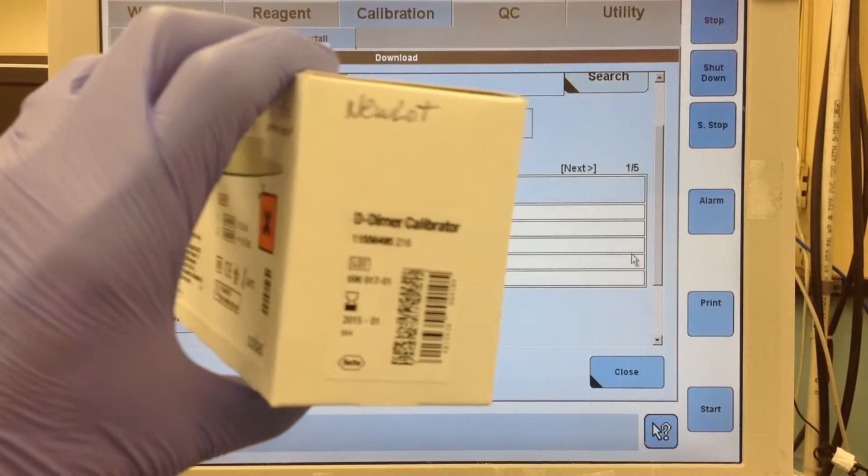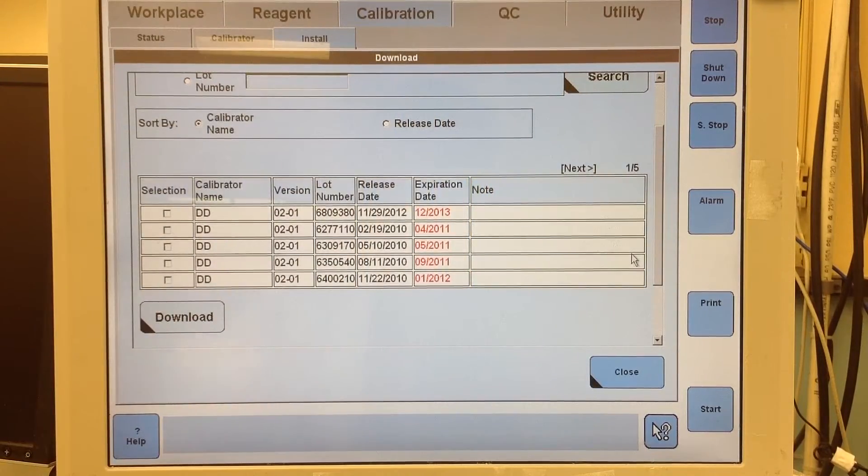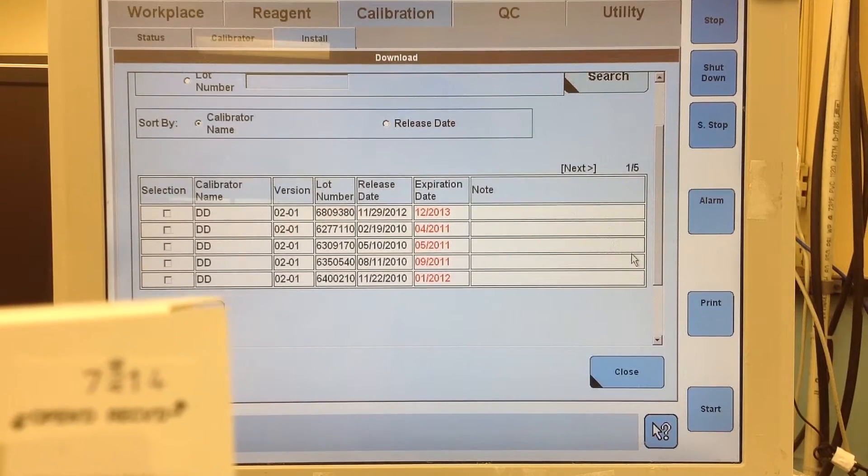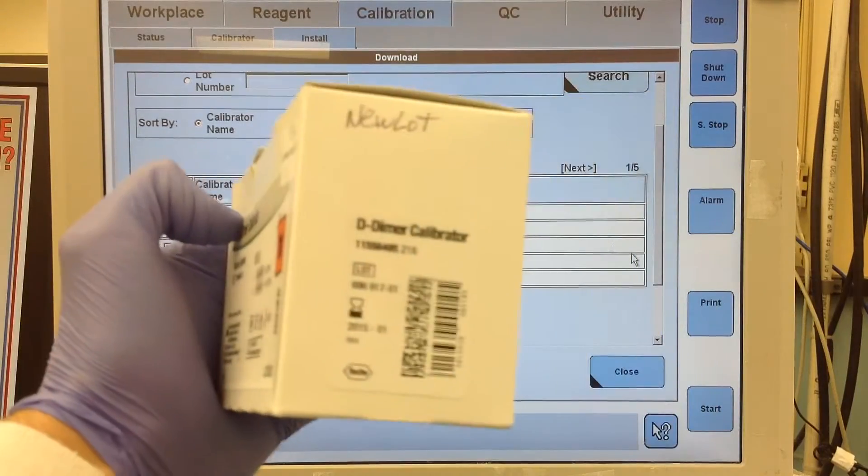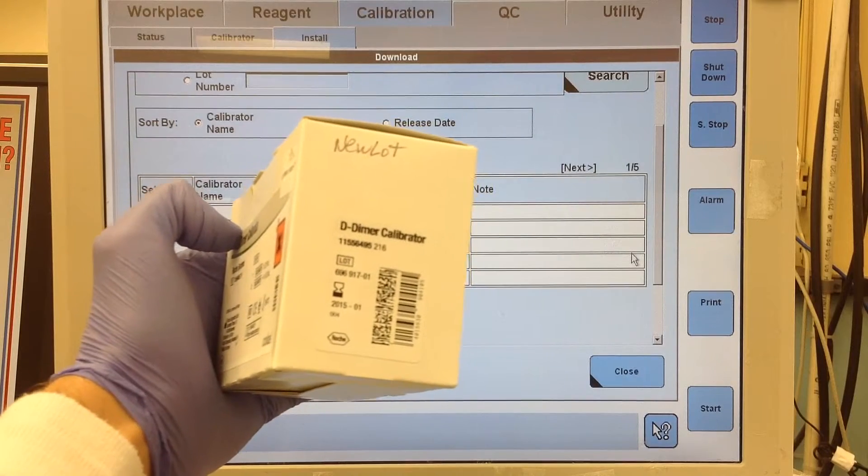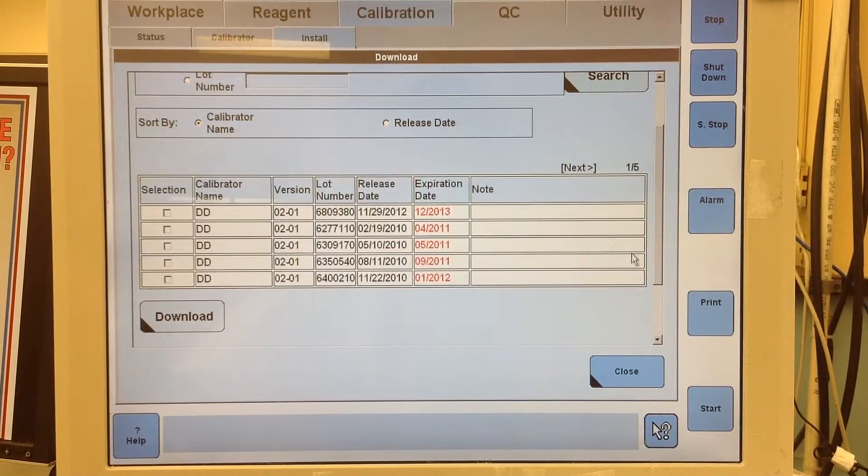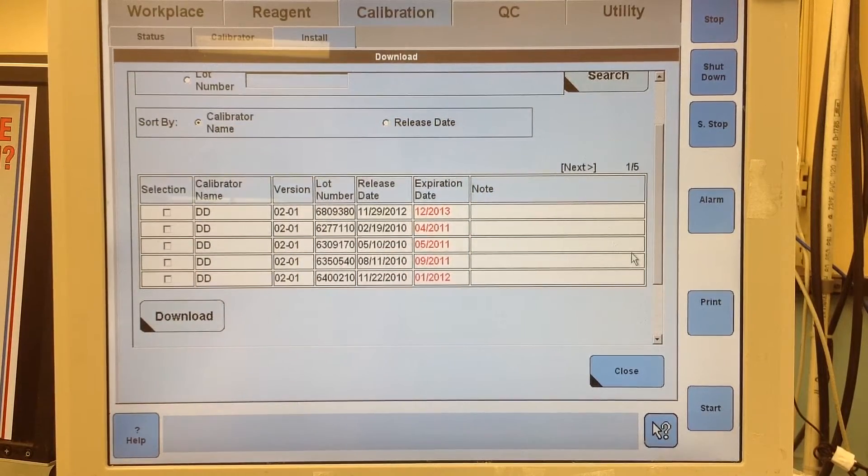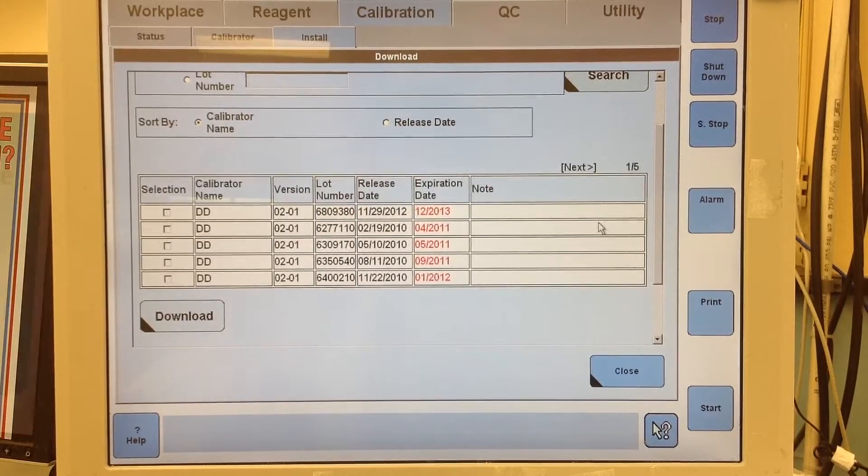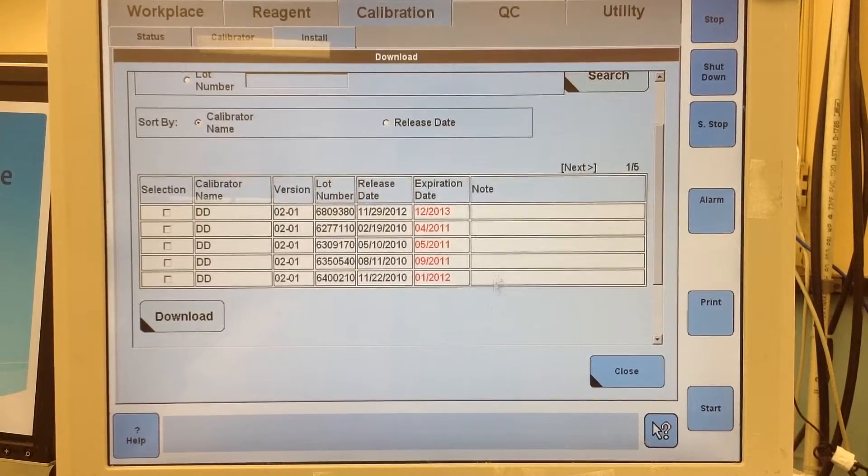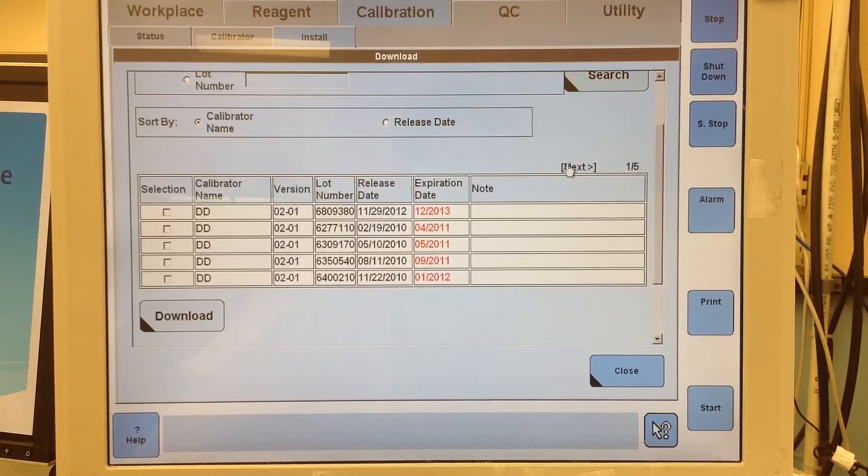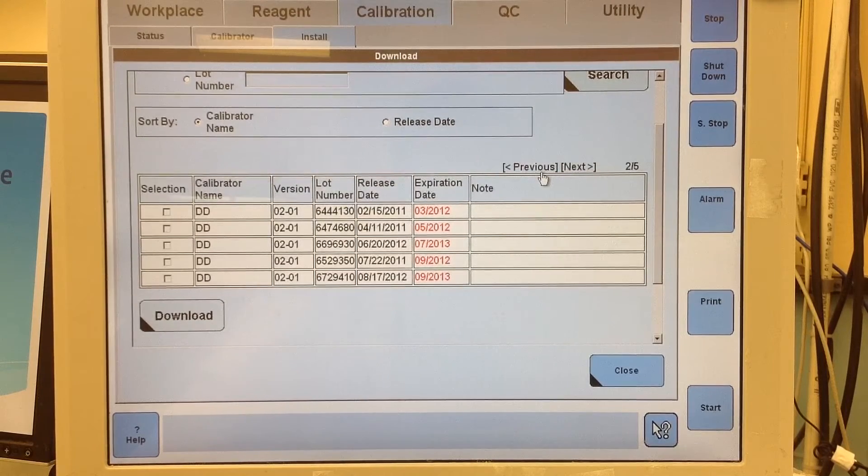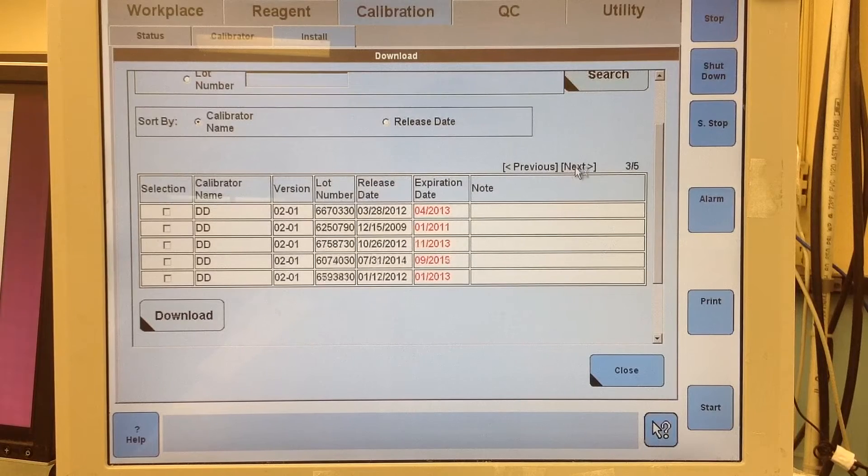It's not coming into focus. Anyways, the lot is, let's see, so it's 696. Let's go to the next tab. I'm looking for 696917.